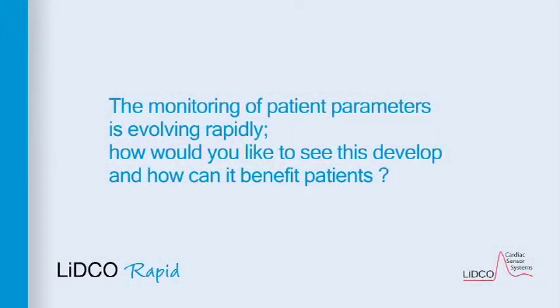The monitoring of patient parameters is evolving rapidly. How would you like to see this develop, and how can it benefit patients? Well, I think the use of combined monitoring using LiDCO, BIS and cerebral oximetry technology has allowed us to individualise goal-directed therapy. Goal-directed therapy, to my mind, is no longer based on population controls with figures almost plucked out of the air, the 600 mils mentioned earlier. It is based on what the individual patient has been doing prior to surgery and trying to maintain that value. This is now possible with the combined use of LiDCO, BIS and cerebral oximetry technology.